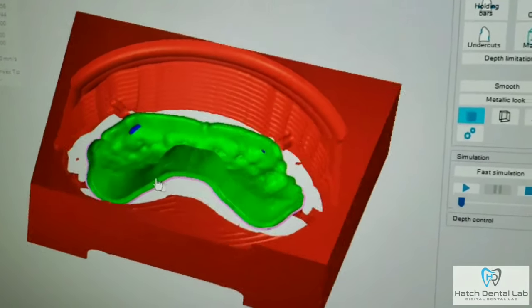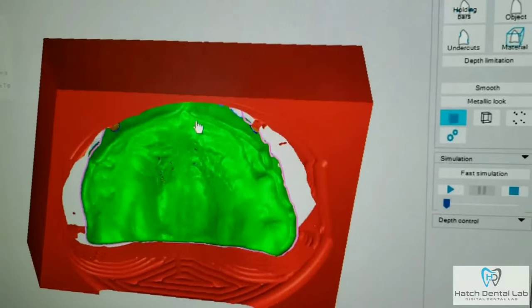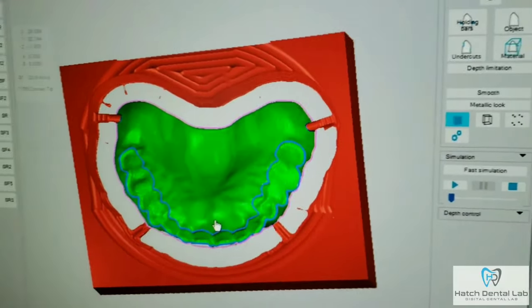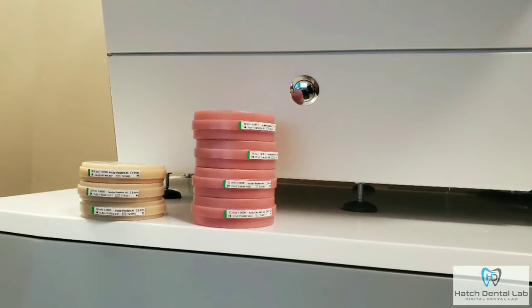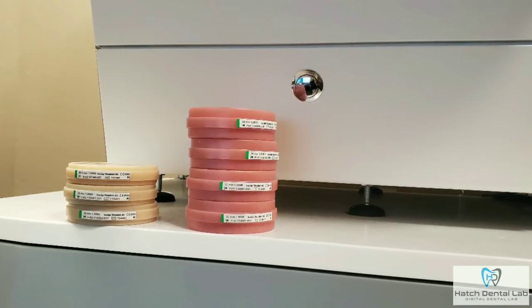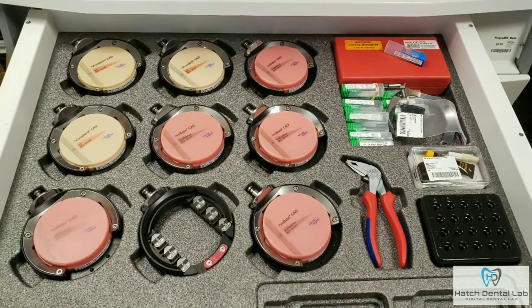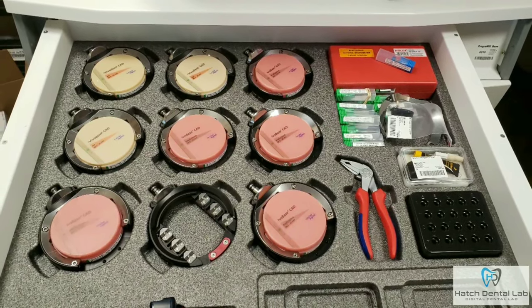Next, we send the case to the CAM software which shows us the simulated milling strategy so we can make sure the denture is going to mill properly. The denture will be milled from IvoClар 98 millimeter pucks. With traditional dentures, you process the denture usually with heat, and while the monomer and polymer polymerize, there is usually shrinkage that occurs. With a digital denture, the puck is already hardened and ready to mill — whatever the mill is told to do, it does.